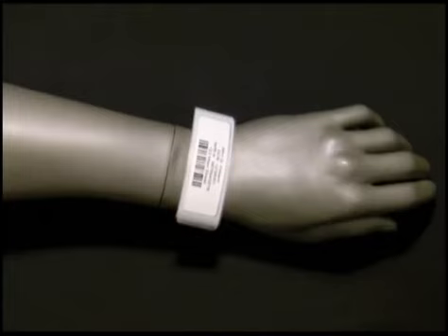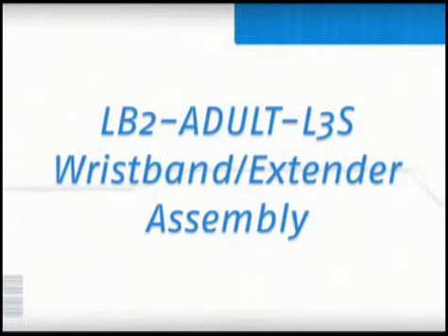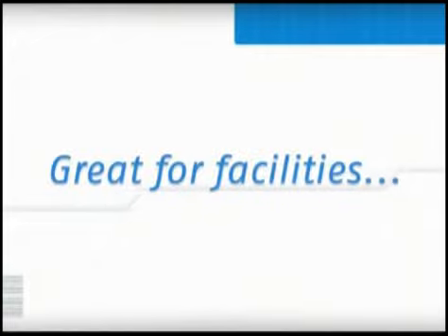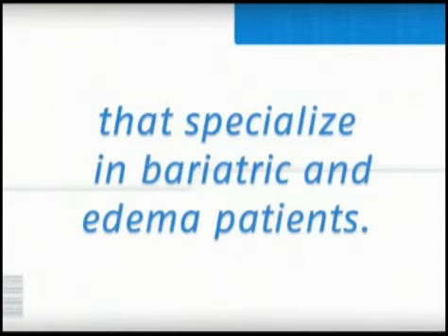This completes the assembly of the LB2 Adult L3S wristband without the extender. The second assembly option for the LB2 Adult L3S wristband utilizes the tamper-evident wristband extender. The extender is great for facilities that specialize in larger patient sizes and conditions, such as bariatric and edema patients.